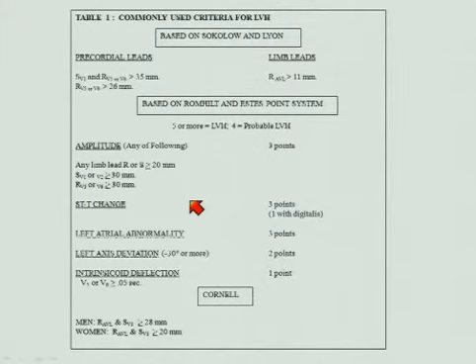Each of these has its own limitations. First of all, you should know that most of these were derived from middle-aged patients. They are not very reliable, not reliable at all for children and young adults. Most of them did not involve large numbers of women in determining the normals, the Cornell being an exception. And they obviously don't take into account habitus, which can affect things as well. So there certainly are limitations. That said, with the electrocardiogram, some of these patterns can be highly specific in the appropriate populations.